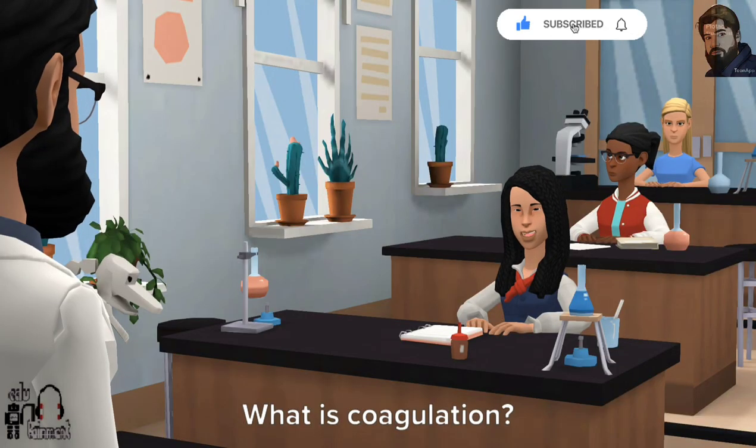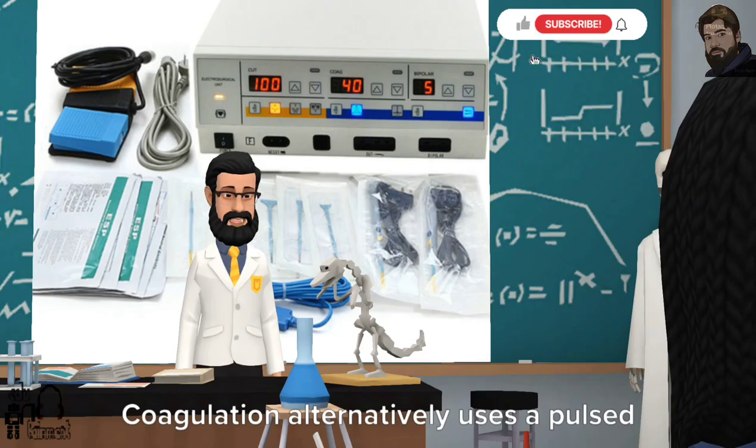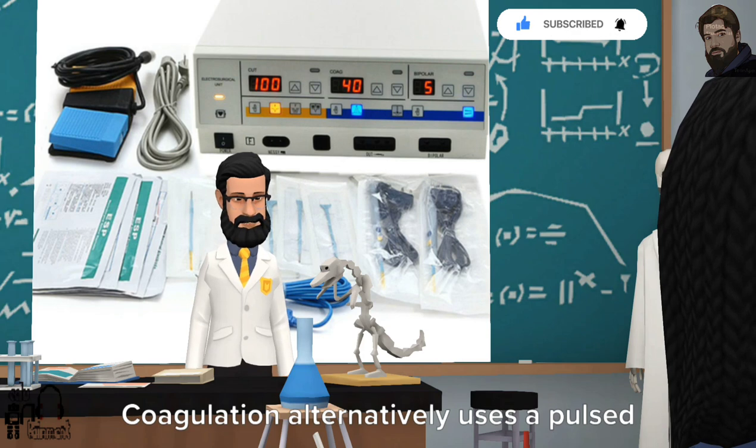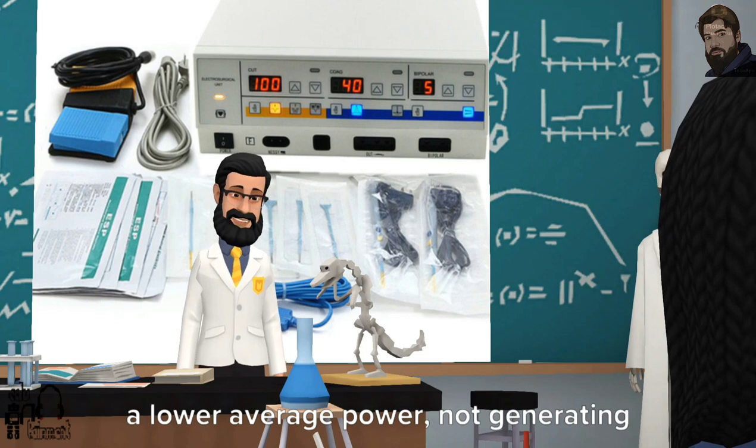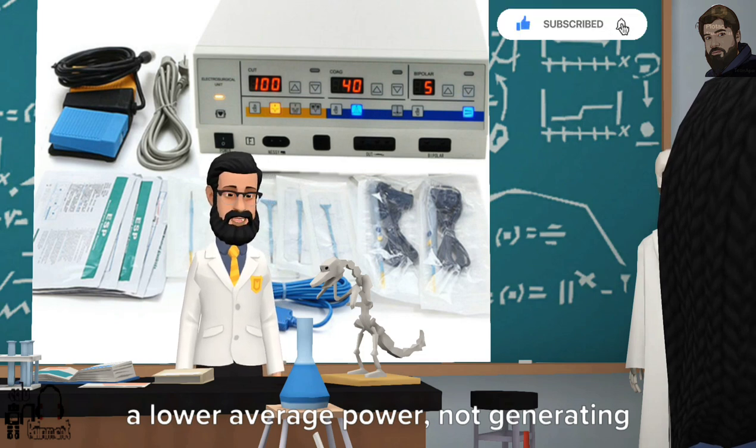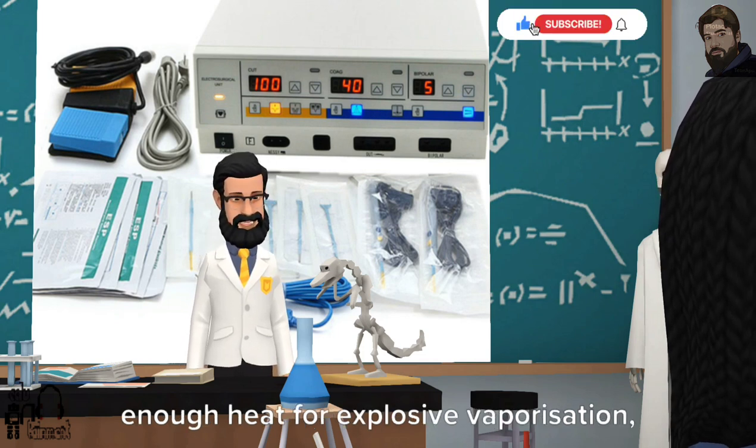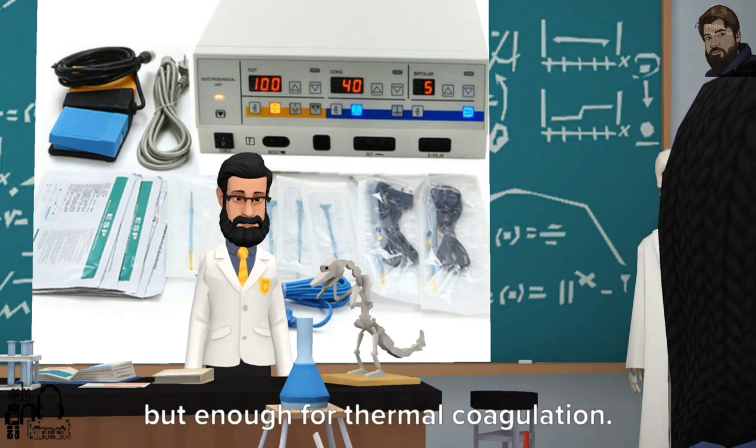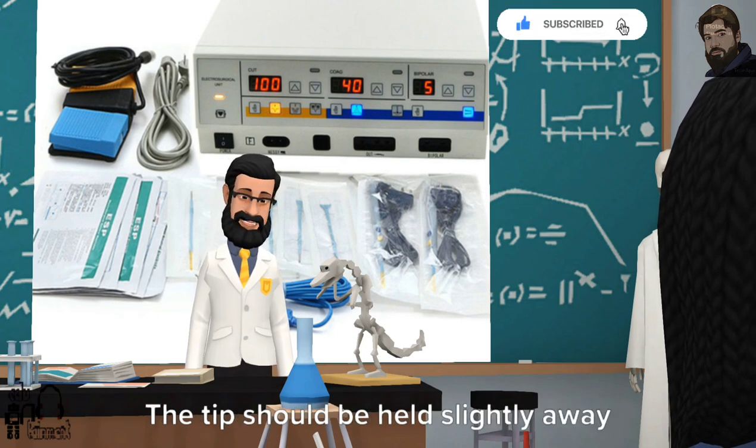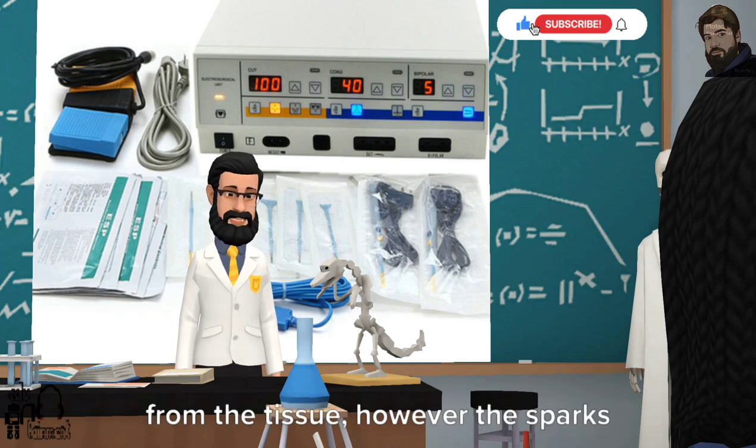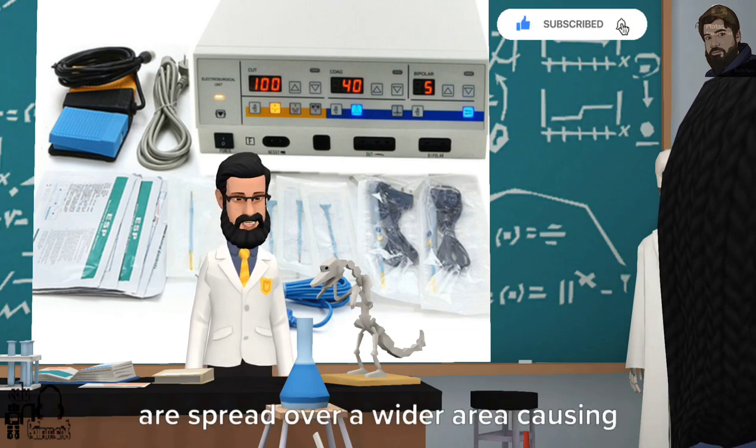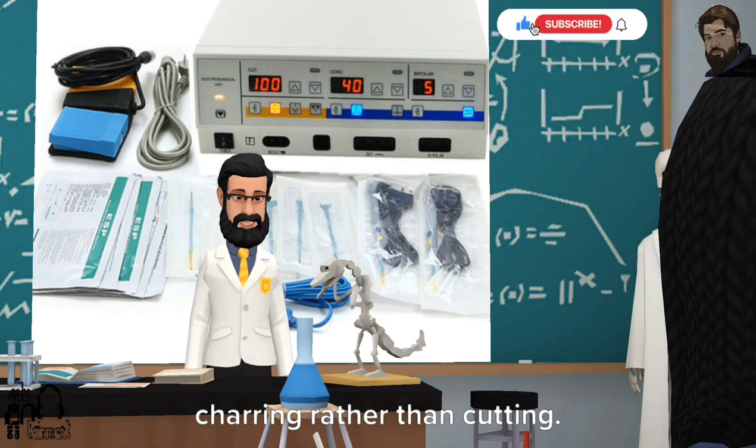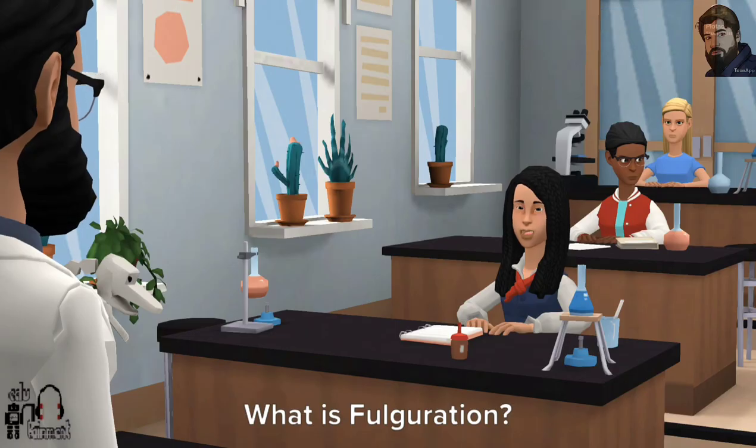What is coagulation? Coagulation alternatively uses a pulsed waveform with a high voltage. In coagulation, the waveform is at a lower average power, not generating enough heat for explosive vaporization but enough for thermal coagulation. The tip should be held slightly away from the tissue, however the sparks are spread over a wider area causing charring rather than cutting.